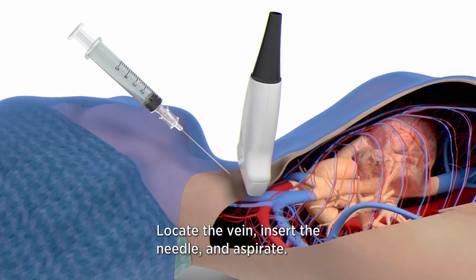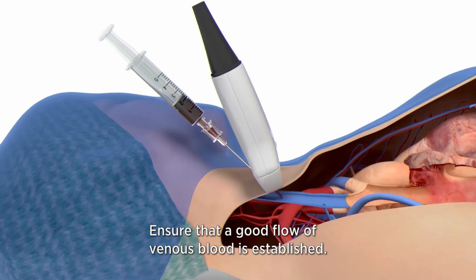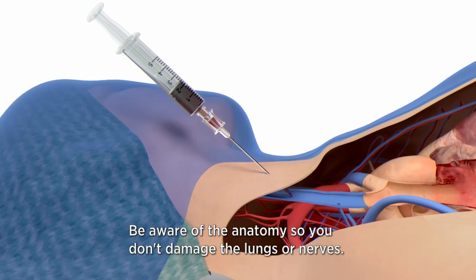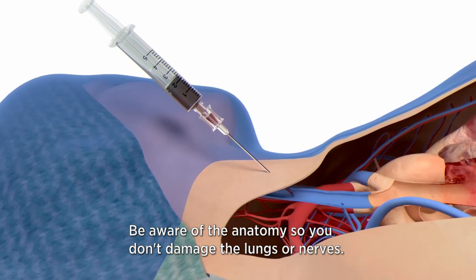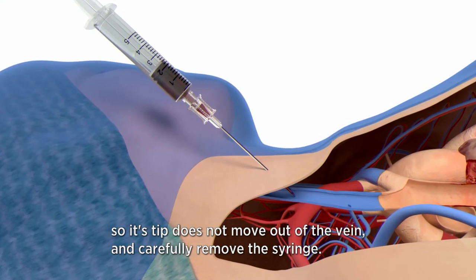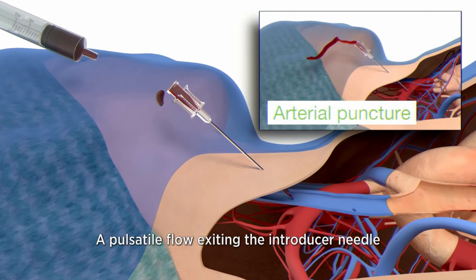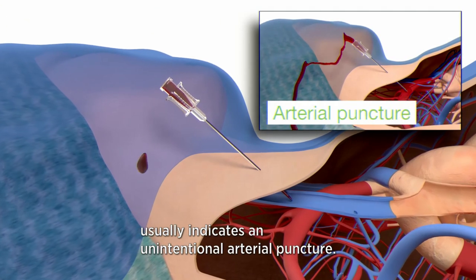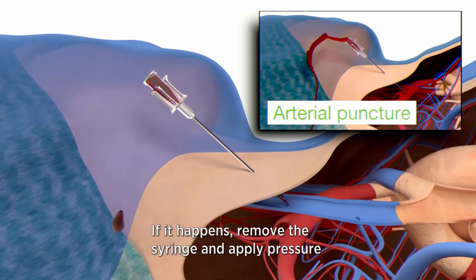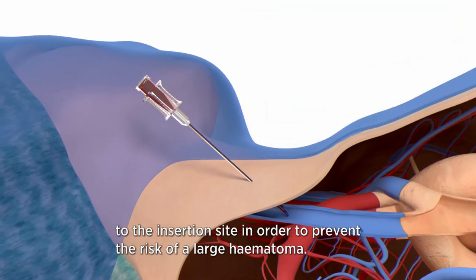Locate the vein, insert the needle and aspirate. Ensure that a good flow of venous blood is established. Keep the syringe attached to the needle and be aware of the anatomy so you don't damage the lungs or nerves. Keep a steady grip on the needle so its tip does not move out of the vein and carefully remove the syringe. A pulsatile flow exiting the introducer needle usually indicates an unintentional arterial puncture; if that happens, remove the syringe and apply pressure to the insertion site to prevent the risk of a large hematoma.